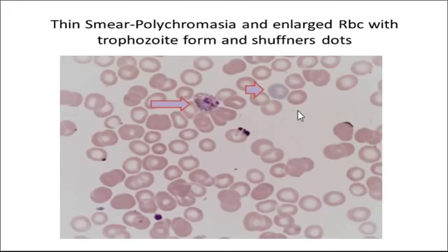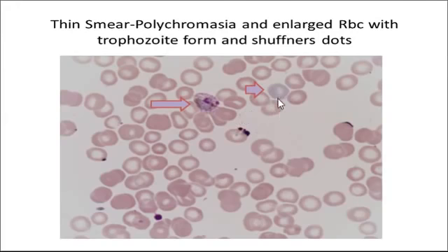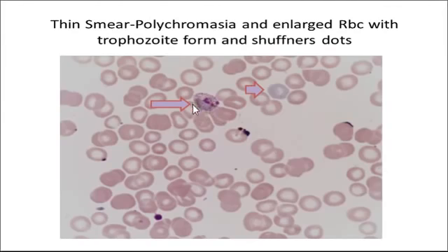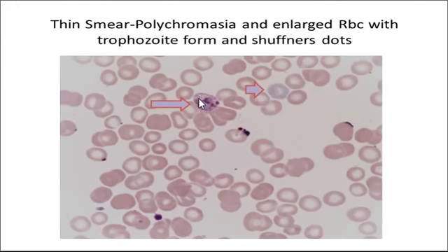When there is infection by a malarial parasite, there will be RBC destruction. In response, bone marrow production increases and naturally more polychromatic cells and normoblasts will be seen in the smear. Here we can see a polychromatic RBC. Another feature of vivax infection is that the RBC infected by vivax becomes enlarged — you can see the infected RBC is quite larger compared to the uninfected RBCs.